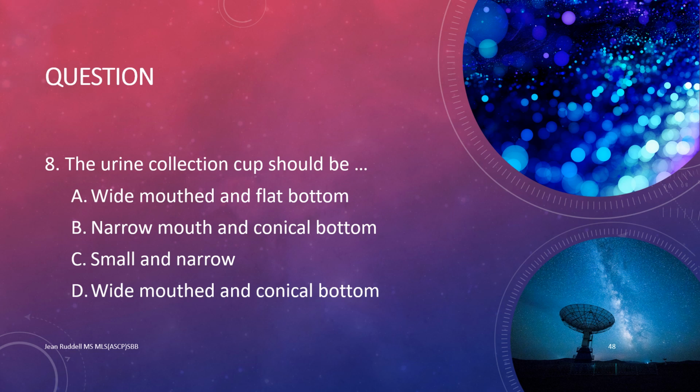Question 8. The urine collection cup should be A, wide-mouthed and flat-bottomed, B, narrow-mouthed and conical bottom, C, small and narrow, D, wide-mouthed and conical bottom. The answer is A, wide-mouthed and flat-bottomed.